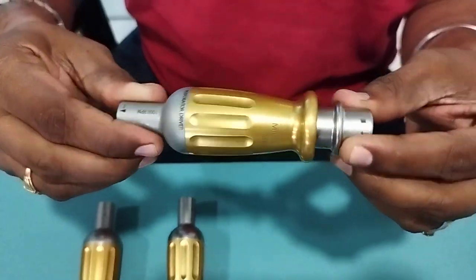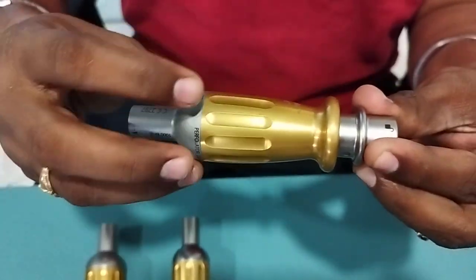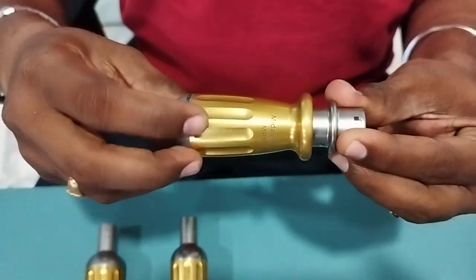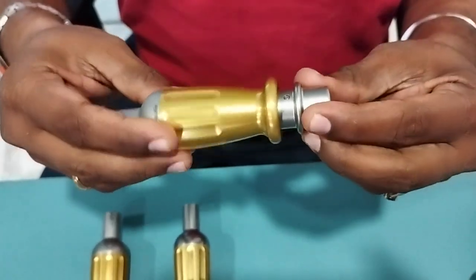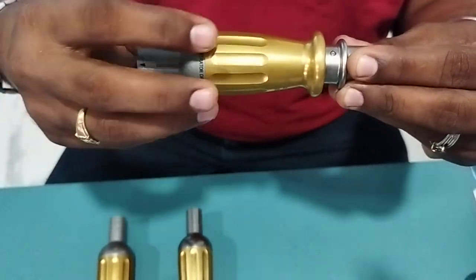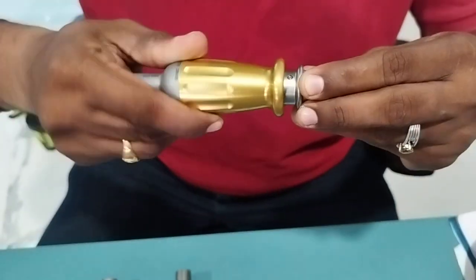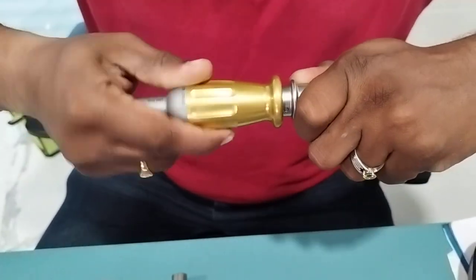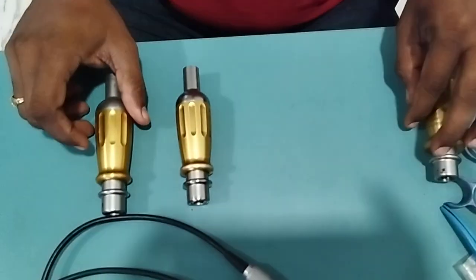If it is a good attachment, you can see it is freely rotating. I am holding this end and rotating — see that it is rotating freely. If it is rotating freely, understand it is working fine. Even when I apply pressure from both sides and rotate, there is no issue. So this is a good attachment.